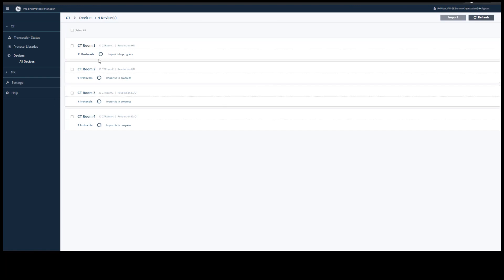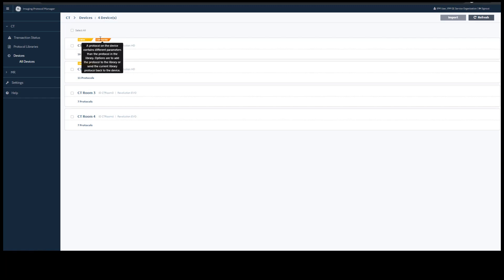In CT Room 1, you can see we have five new protocols and two deviated protocols. New protocols are protocols that are not in your standard library. Deviated protocols are protocols that are in your standard library but have since changed.